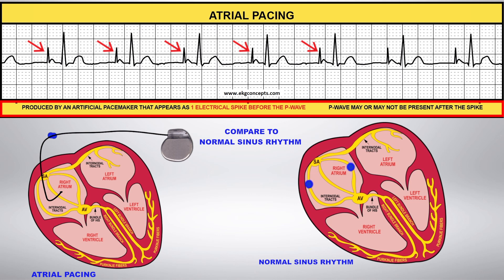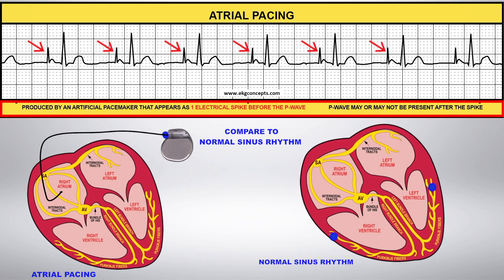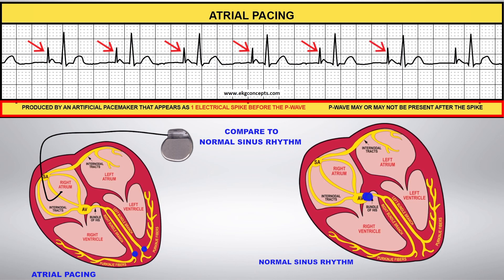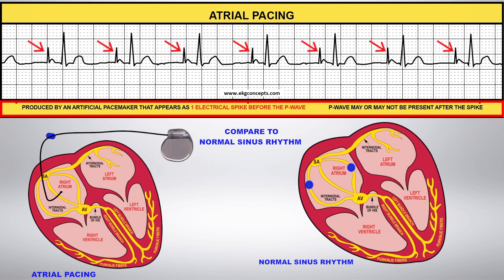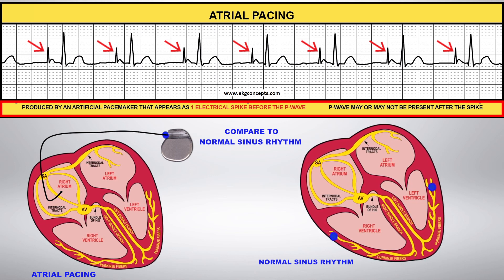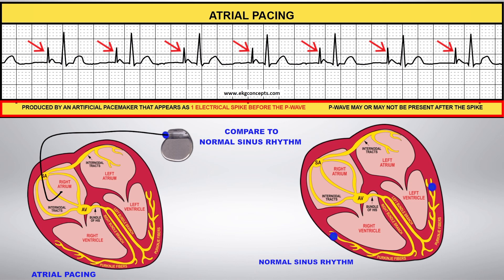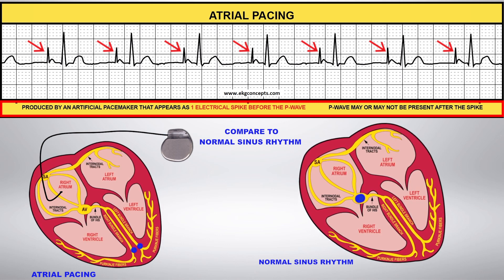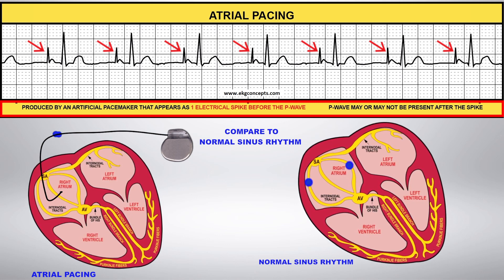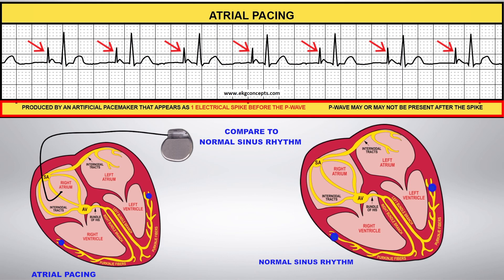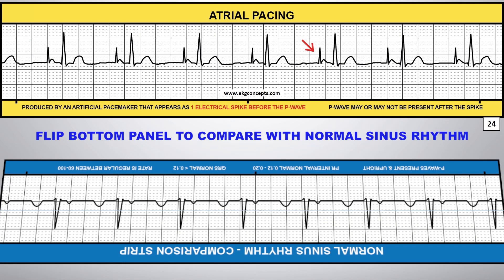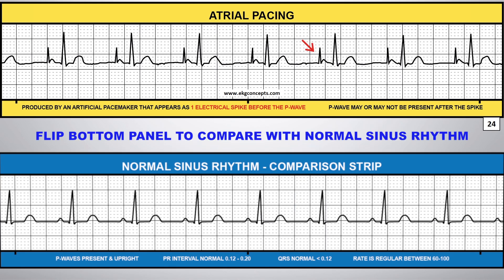Compare this to normal sinus rhythm. You can flip the comparison strip on the bottom panel to compare this rhythm to normal sinus rhythm, all the way to the left.